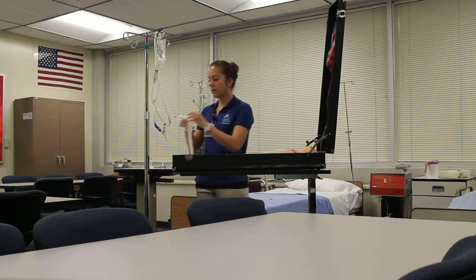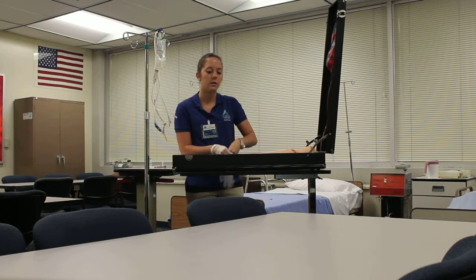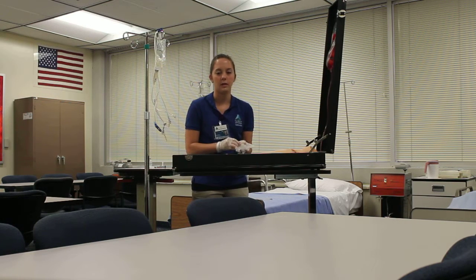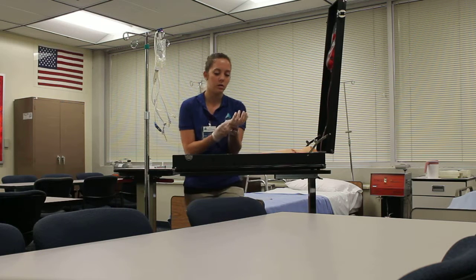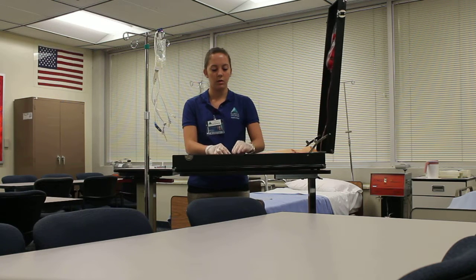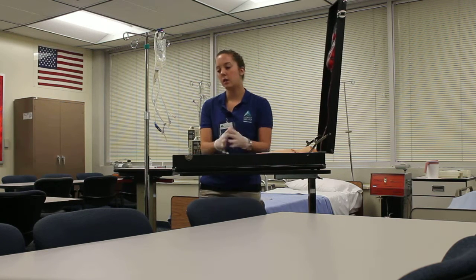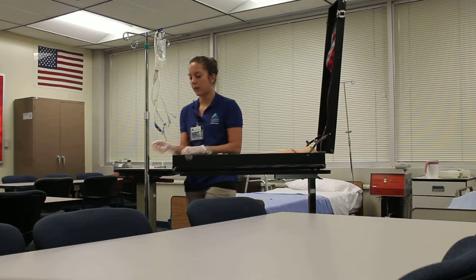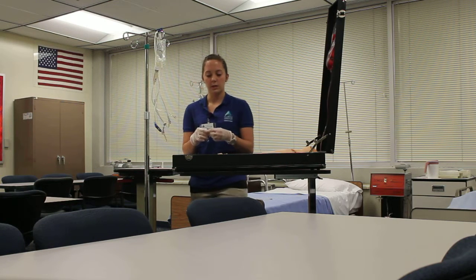The first thing I want to do is check the IV site for any phlebitis or infiltration, and I'll also palpate the IV site for any kind of tenderness that they may be having. Okay, so everything looks good. Before I hook up my IV, I want to flush the IV tubing and check for patency.